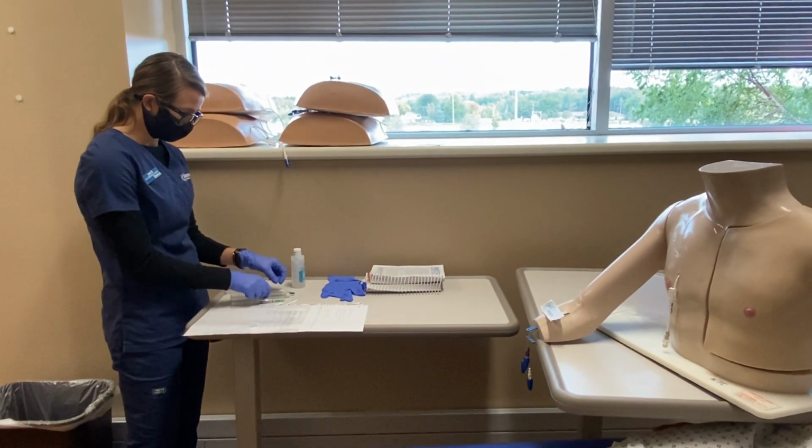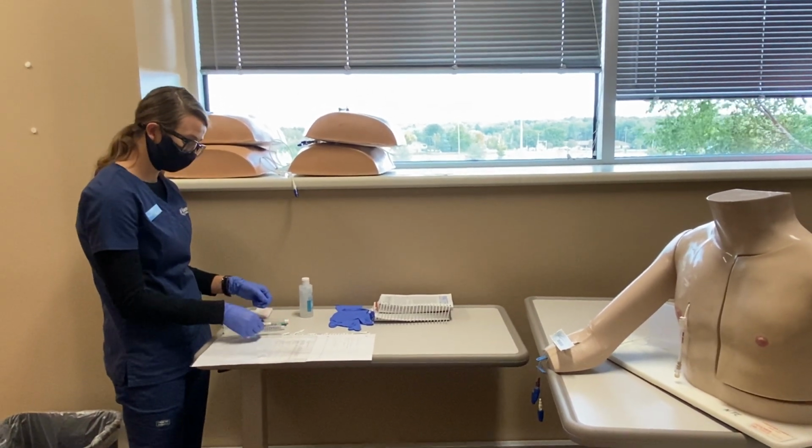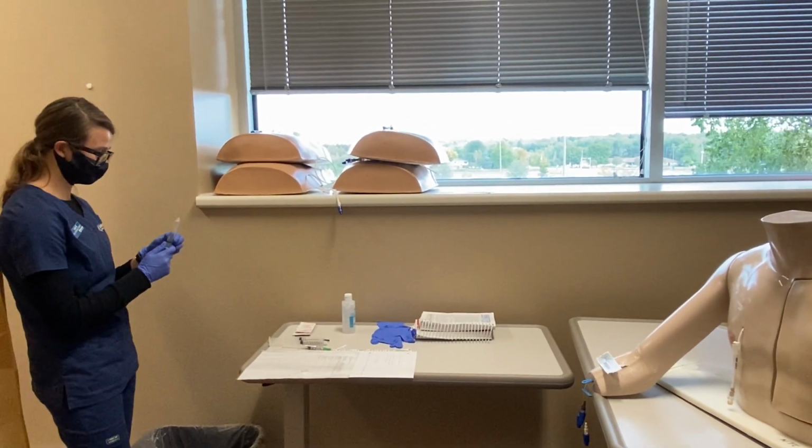I have also checked that the normal salines are all not expired. Neither is the hydromorphone. I'm going to go ahead and I'm just going to wrap these.